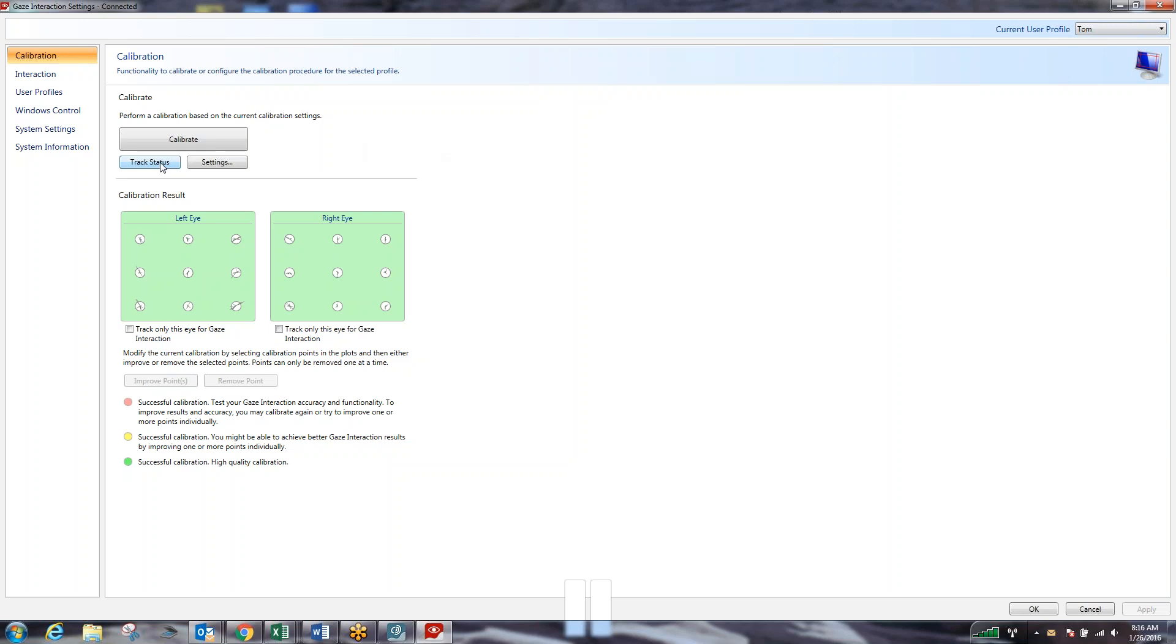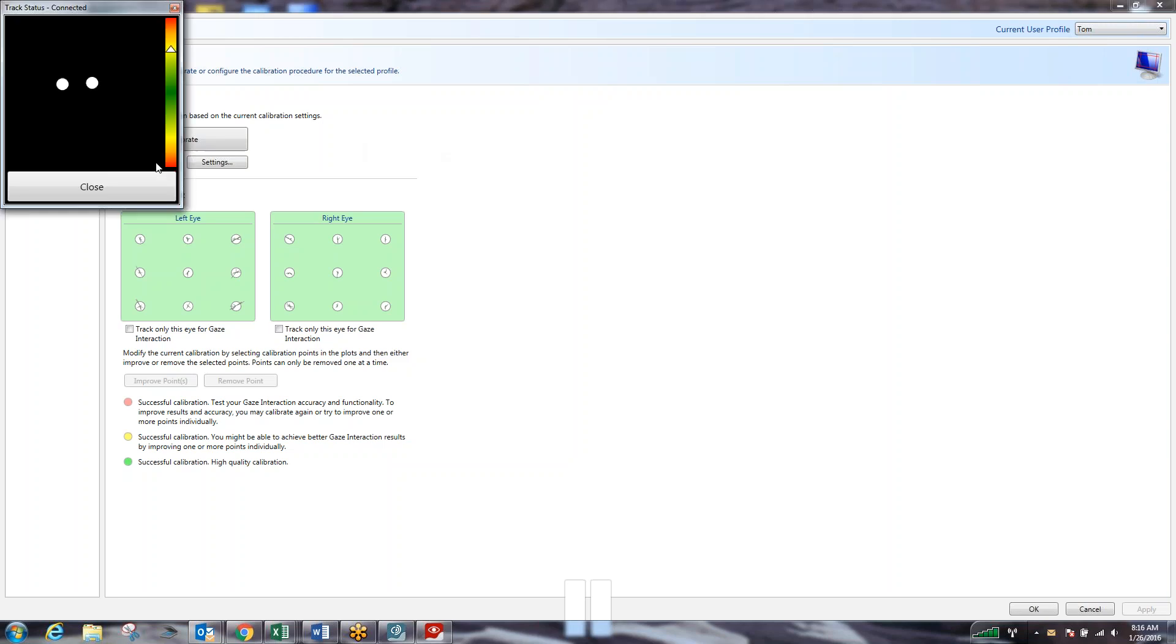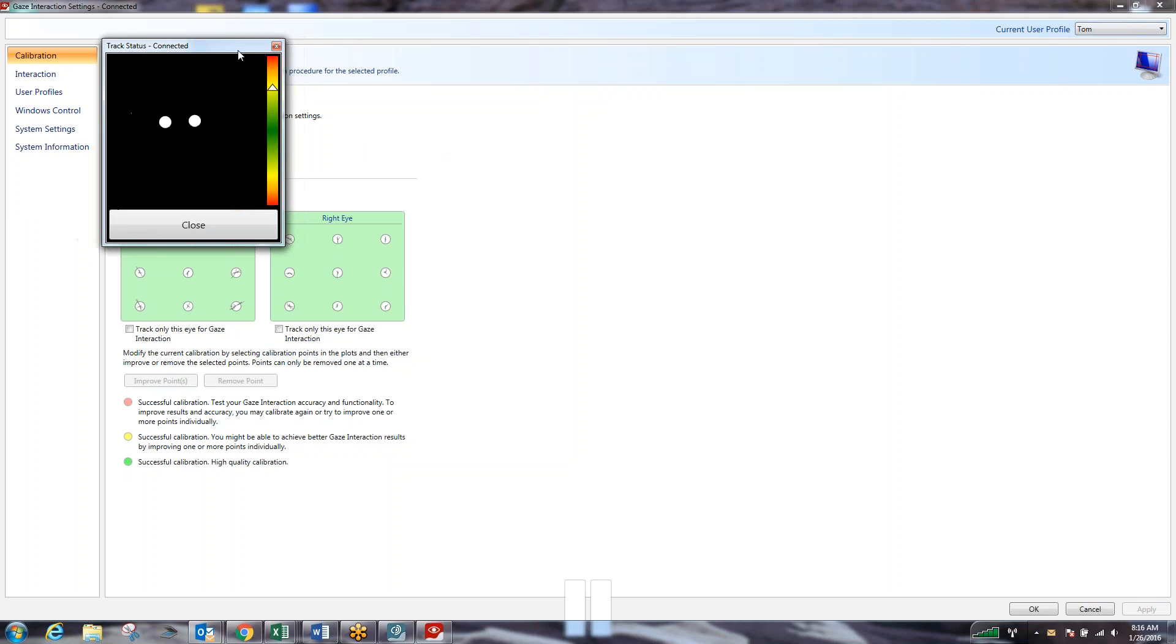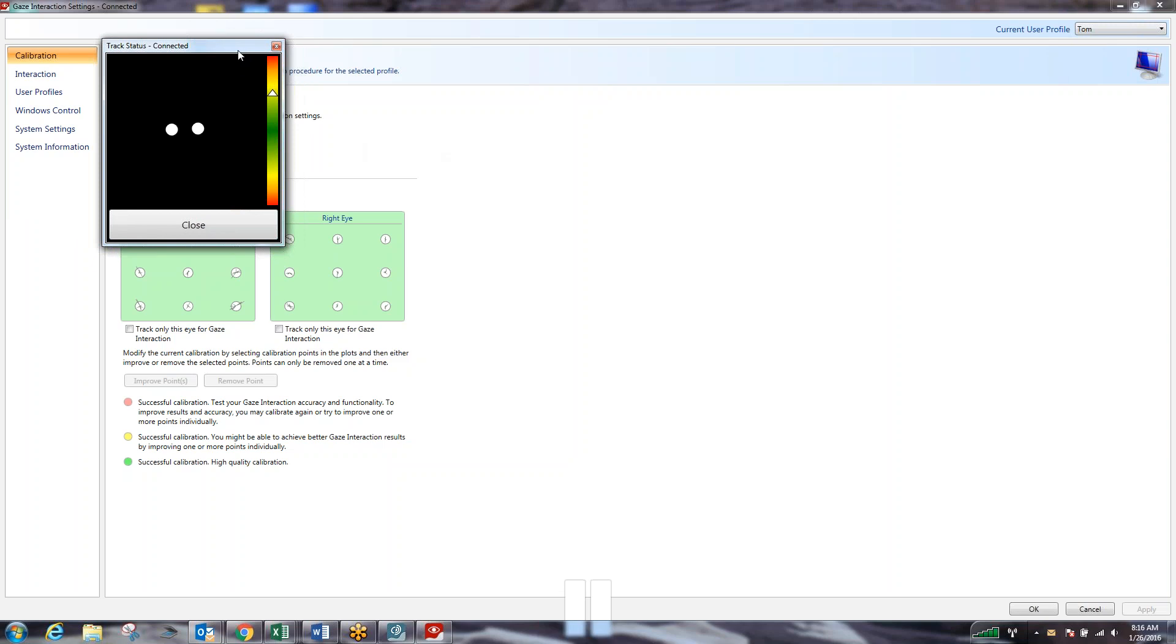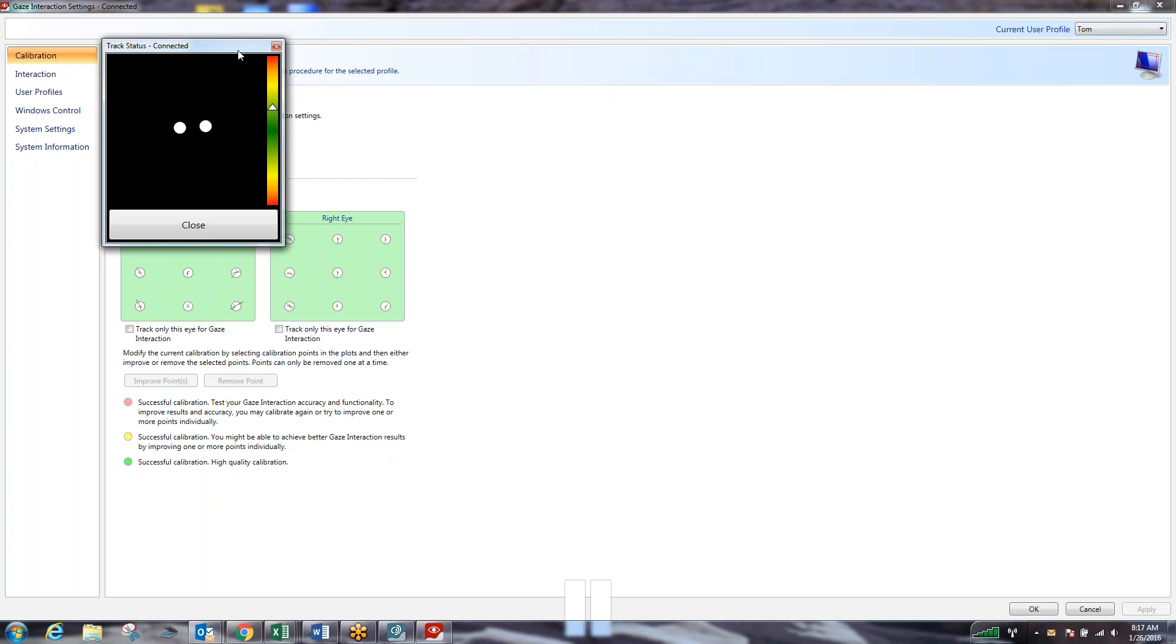So what we're going to do now is stay on the calibration tab and utilize the track box or the track status box. What this track status box does is it shows us where our eyes are in proximity to the device and if the device is picking it up properly. Our goal is to have both white circles, which represent our eyes. As I close one eye and then the other, those white circles disappear. If I blink completely, they disappear. You can also tell if someone is having a hard time calibrating if the white circles flutter or do not stay a solid white.